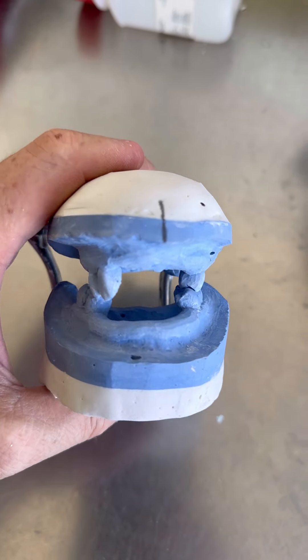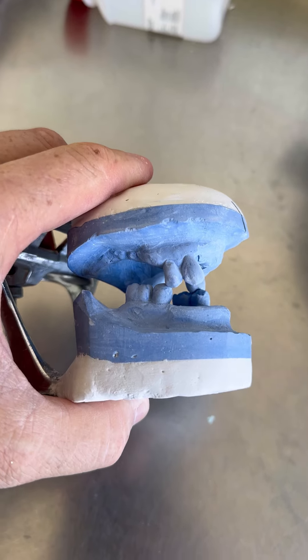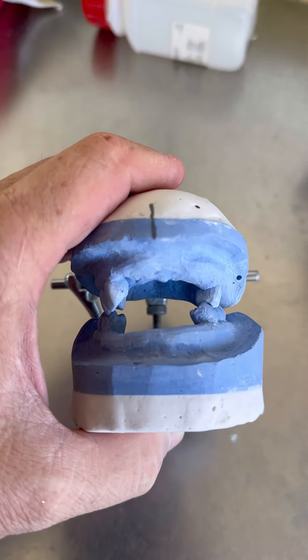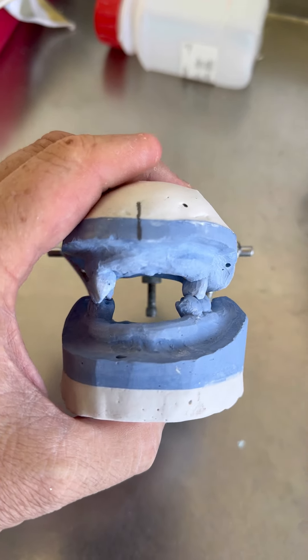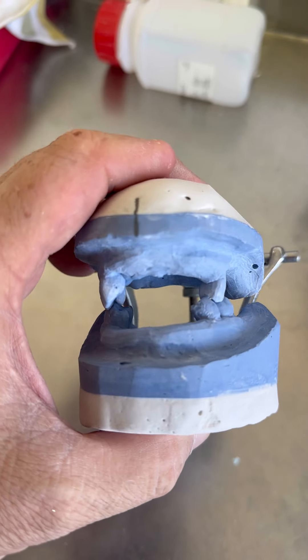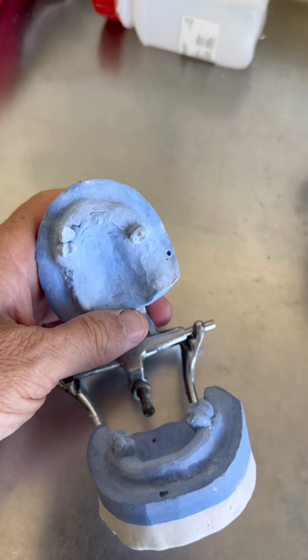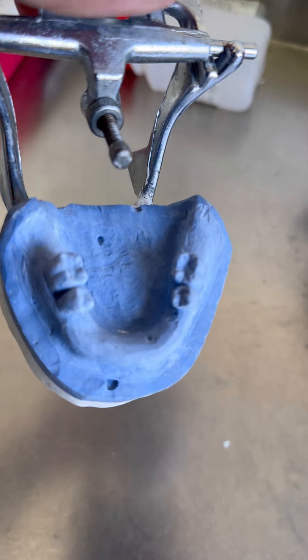Вот такая вот у нас получилась картина. Все зубки, на которых поставили крест, я их удалил, убрал. Вот осталось вот так вот. Теперь сюда надо сделать крючки и нужно будет ставить зубы. Вот такая вот история получилась у нас.